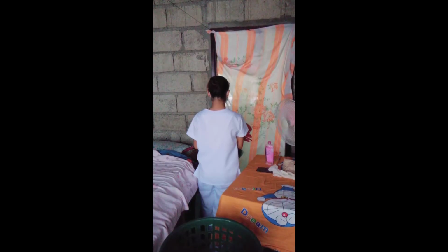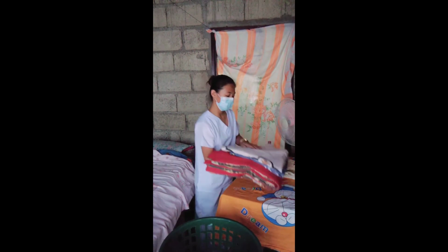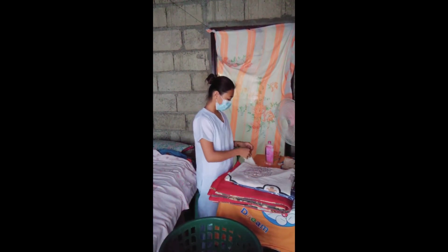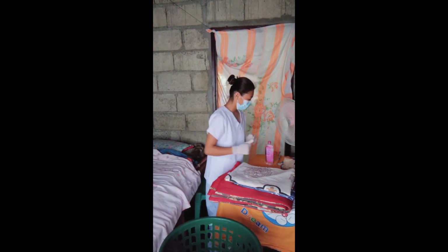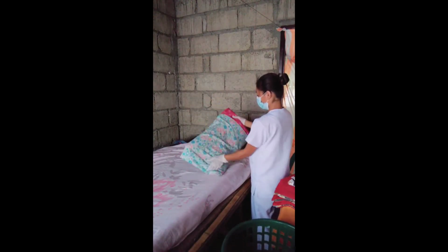I will be guiding you, ma'am, in some positions. I hope for your cooperation. Let's start. To make an occupied bed, first gather the appropriate supplies with the linen stacked in order of use from top to bottom. Place the clean linen on a clean surface, such as a bedside table. Next, put on the gloves. Then put the pillow, if to be used, on a chair.